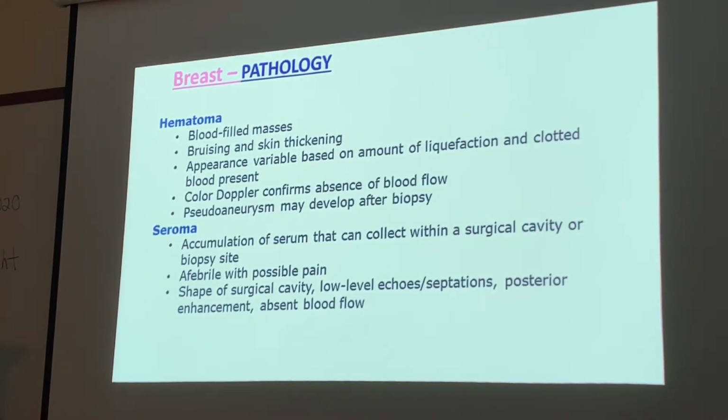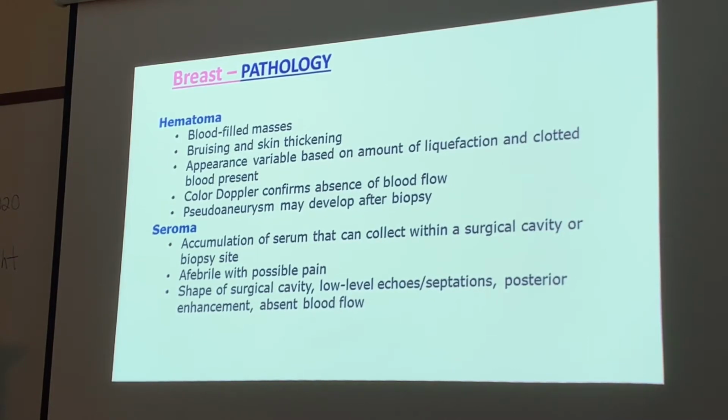Let's talk about a hematoma. Hematoma, of course, guys. Hema meaning blood. It's a blood-filled mass with bruising or skin thickening. Right. The appearance is variable based on the amount of liquefaction and clotted blood present.